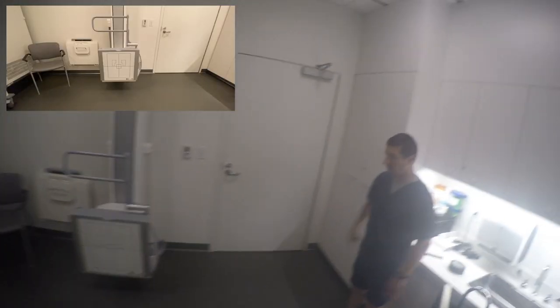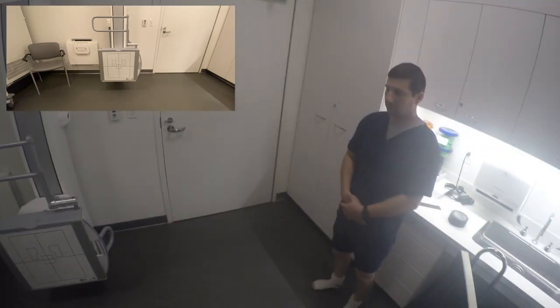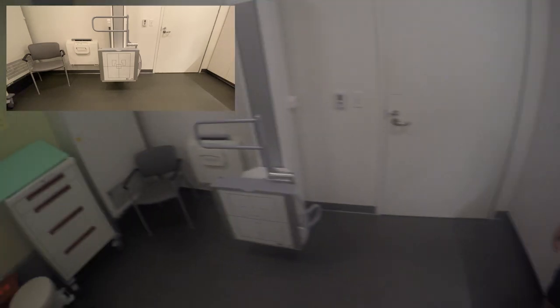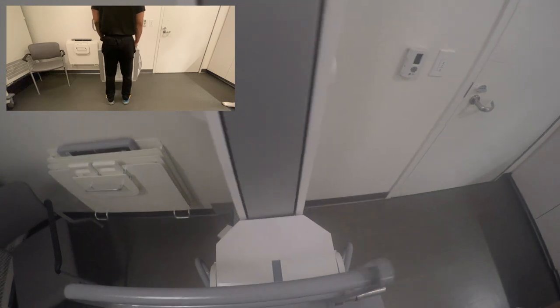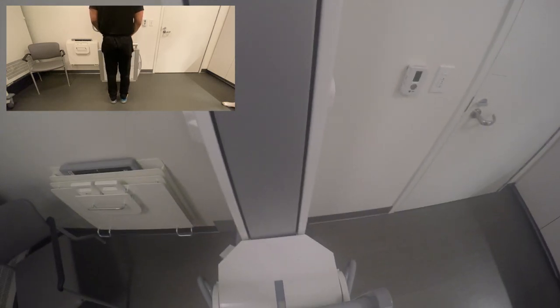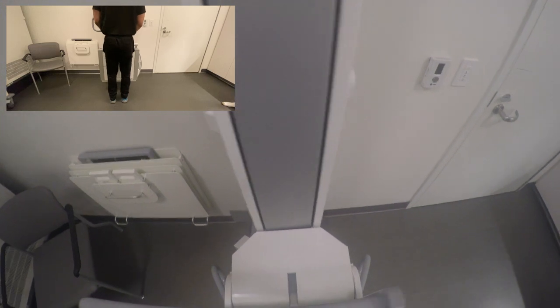Alright sir, so we're looking at both of your knees, correct? They want to see some images with you bearing weight on it, so that's why I had you take off the shoes — so you're on level ground. I'm going to demonstrate what I need you to do. We're going to get you close to this board, get your knees as close as they can get to each other, rotate your knees so they're pointing forward, then just bend your knees and relax on this board.